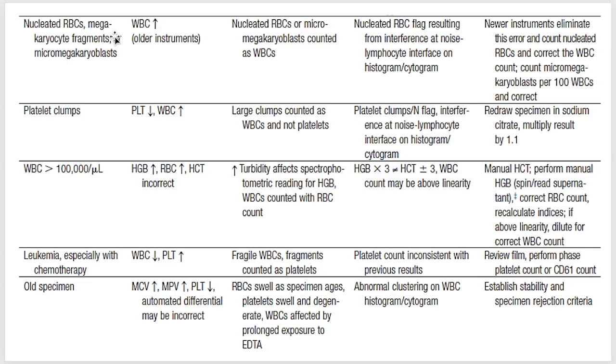So, how can we address such problem? Newer instrument, eliminate these errors. So, mga high-end na mga instrument na i-eliminate na ito ng problem na to. However, count the nucleated RBC and correct your WBC count. So, basically, you will just do manual counting.